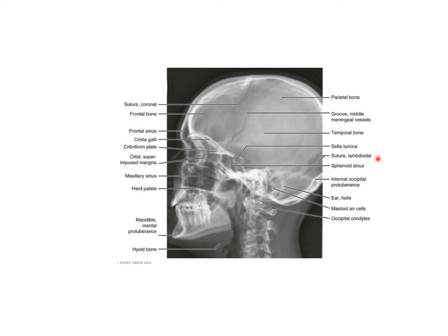This is another x-ray of the skull lateral view. Here you can see the maxillary sinus, the frontal sinus, and the orbit. Also the internal occipital protuberance, the sella turcica, and the sphenoid sinus. Here you can clearly see the groove for the middle meningeal vessels. The middle meningeal artery is a branch of the first part of the maxillary artery, with frontal and parietal branches.